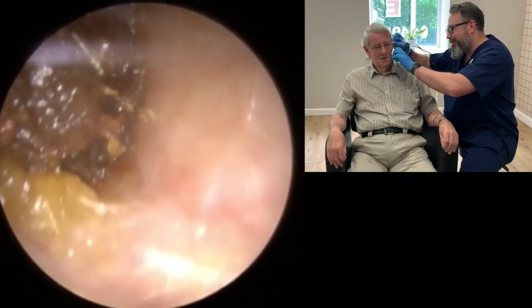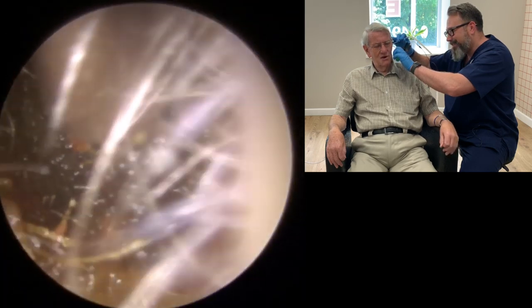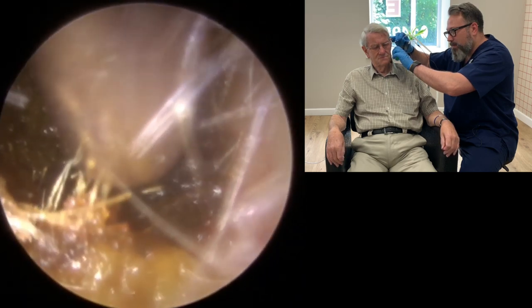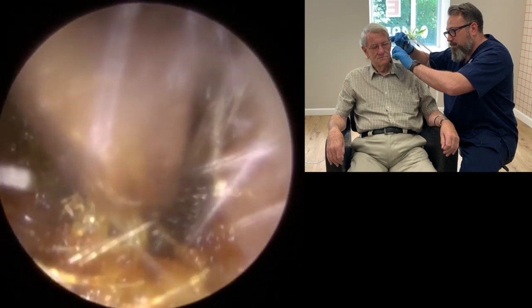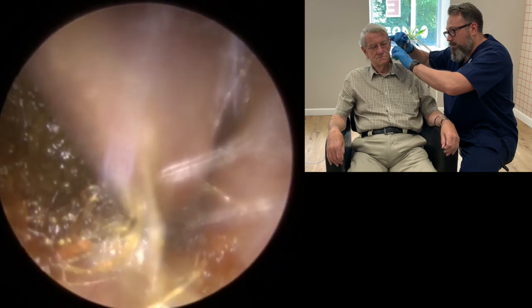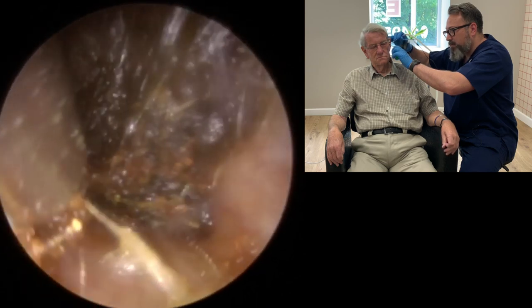So just popping back into the ear canal now. What we're going to do with this, you can see we've got a piece that's sitting a little bit deeper in the canal. So we're just going to try and break a couple of the softer pieces off here first of all. And just trying to work our way around the outside edge of this wax, freeing it up from the canal wall, unsticking it from all the sides. There we are. You can see it just starting to break away some of the softer pieces.